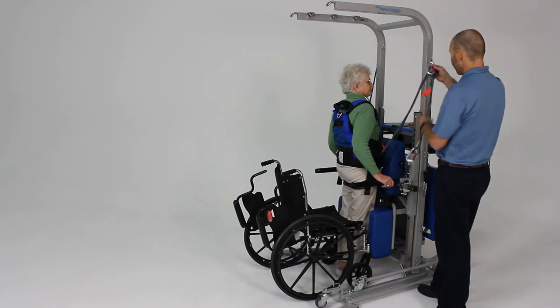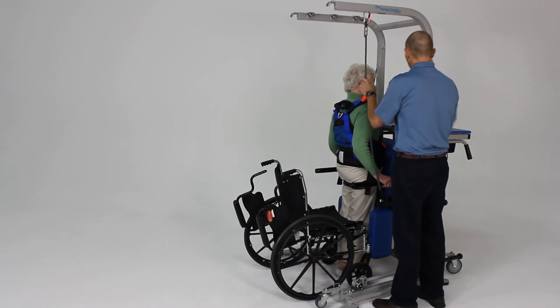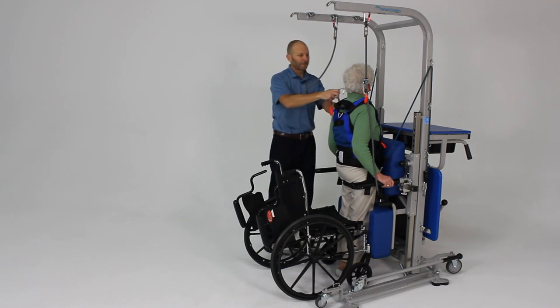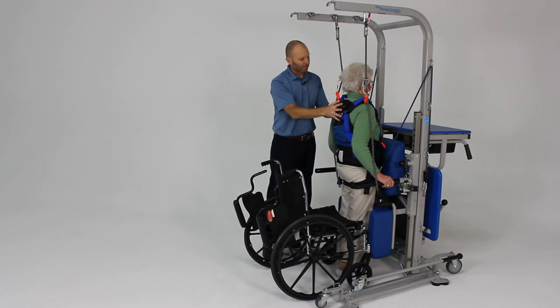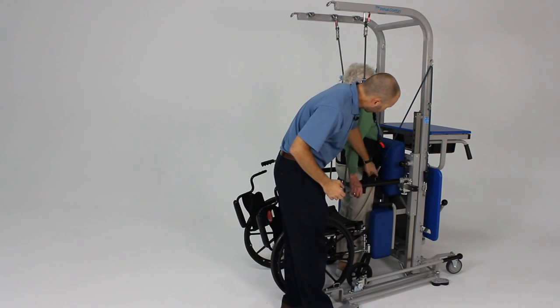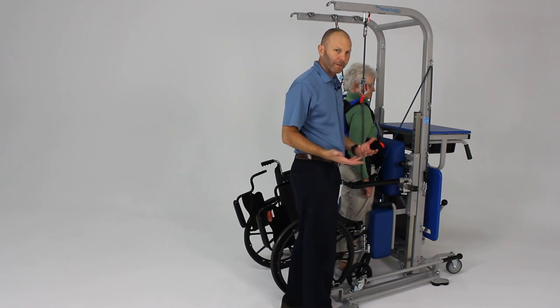We've got our safety lines here and we can add those to provide some support to the upper body as needed. Just take up the slack in the rope to give them that support. There also are additional straps that can be added to the D-rings and connected to the unit to provide a more stable anchoring of the pelvis and provide more of a standing type frame effect.